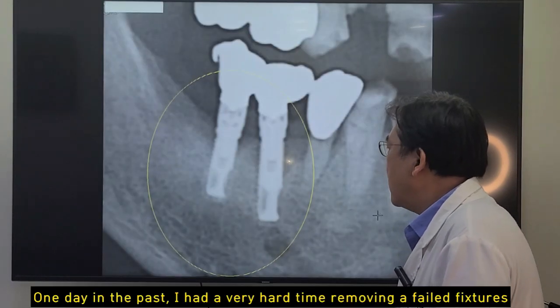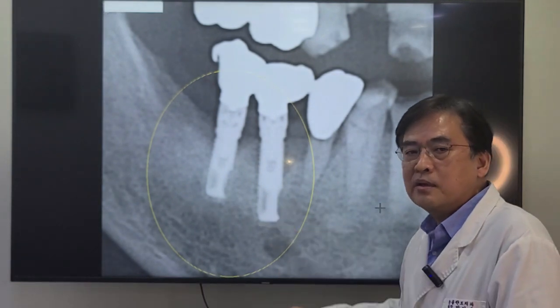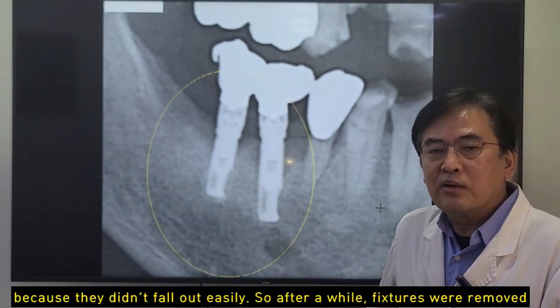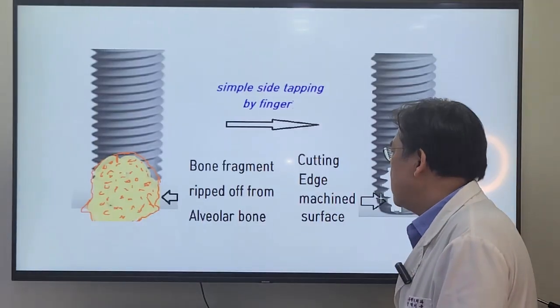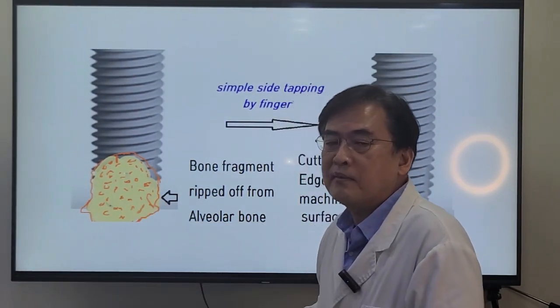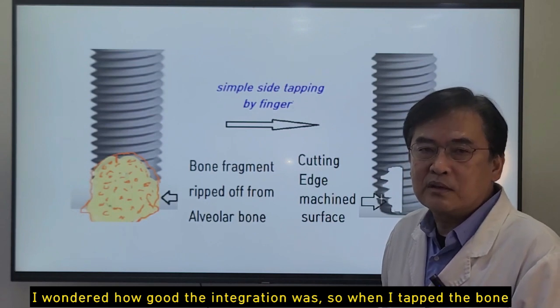One day in the past, I had a very hard time removing failed fixtures because they didn't fall out easily. After a while, the fixture was removed with a bone fragment attached to the cutting edge. I wondered how good the integration was.